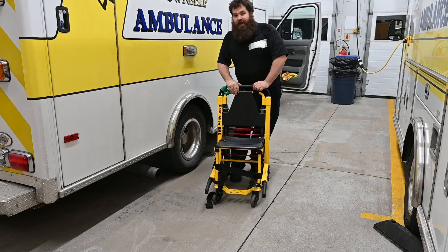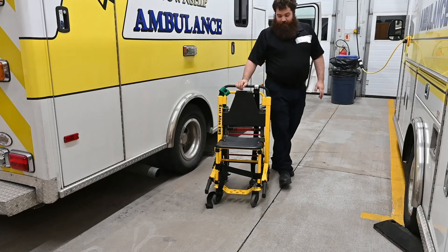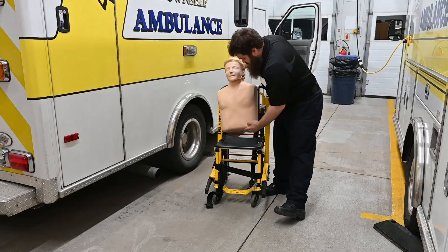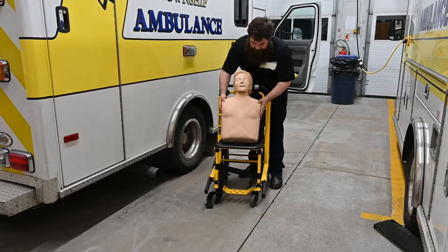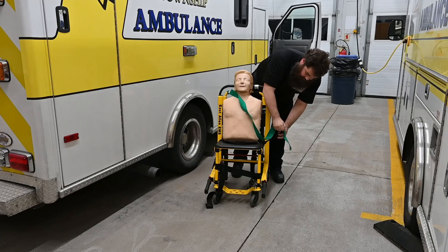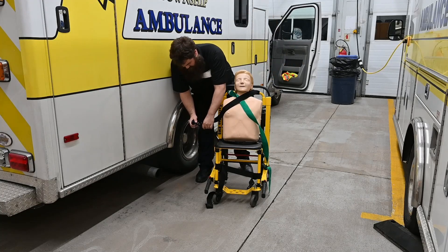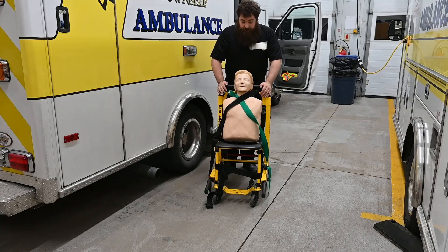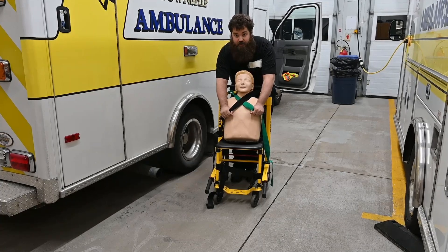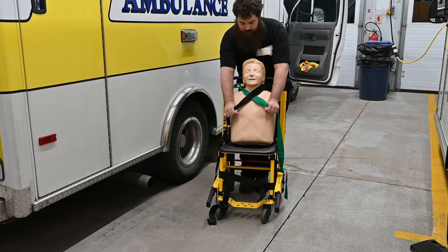I'm going to ask my assistant Crash to throw me the dummy and we'll actually get this set up. Sir, please sit down in the chair here. What we do is cross the straps. Now at this point I make sure to tell the patient to grab right here — the best place for their hands is right here, because they're not going to be reaching for railings or door frames as we move them out of the area.